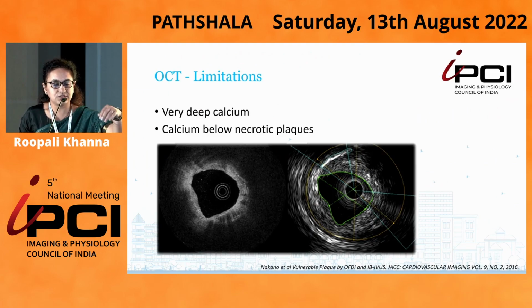There are 2 limitations for OCT: deep calcium cannot be seen, and calcium below necrotic plaques is a challenge. This was an autopsy study in which they found that in patients who had a lipid core below it, they were not able to see the calcium.